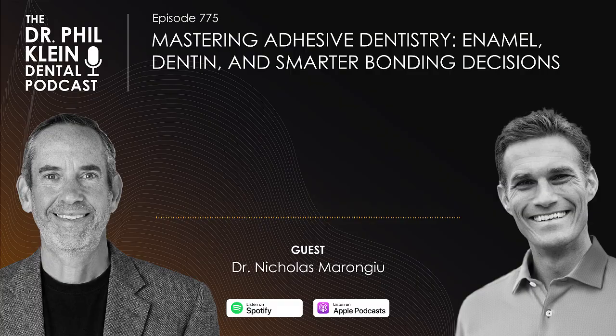But the dentin still gets that self-etch, partial demineralization, which we're looking for, as I talked about with the MDP. It's incredible. Leaving the smear layer in the dentin, we're not opening up all those tubules. We're not collapsing. The most important and critical thing there is that we're not over drying that dentinal surface during our process, making sure that we're blotting and not grabbing our air syringe and desiccating the dentinal surface. We're blotting off the surface, leaving that dentin surface and hybrid layer intact, a little bit moist, not pooling, just enough to keep everything hydrated, so that the MDP primer can really interact with the dentinal surface to get those resin tags infiltrated and to create that hybrid layer and the bonding.